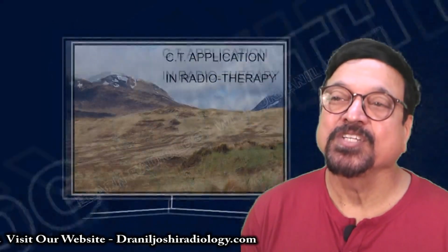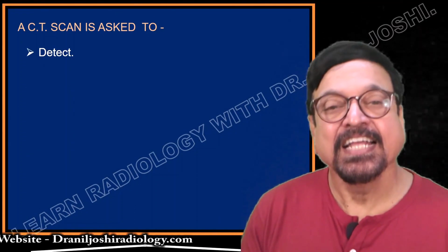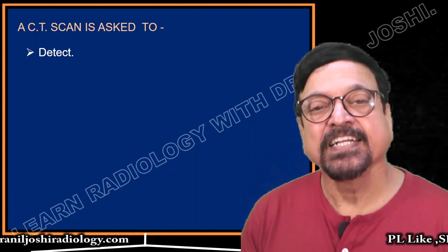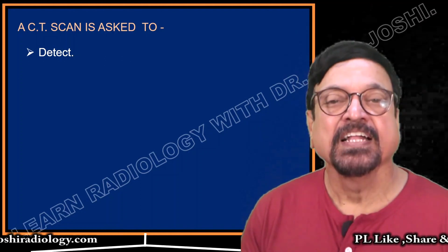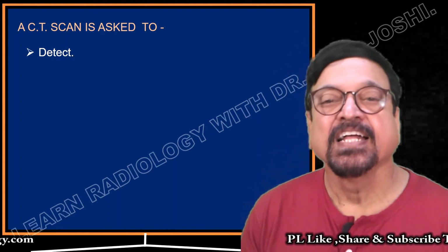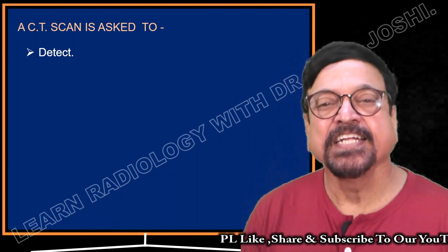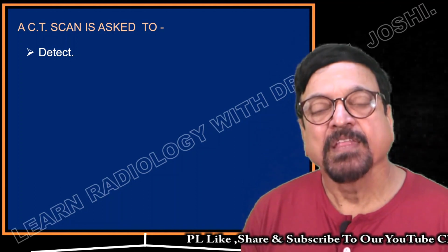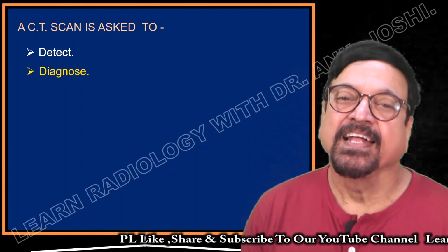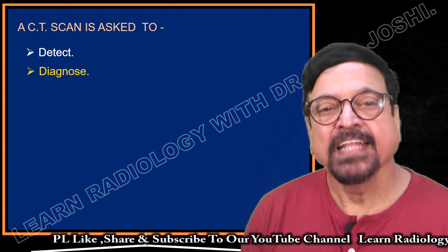Now, what are the applications of CT in radiotherapy? These are newer and still being tried. In addition to the detection of lesions, that is tumors, and detection of space-occupying lesions, then embolizing them with the help of interventional radiology using screening MRI or screening CT units, we take those advantages also for cancer, that is oncology, and its role in radiotherapy.